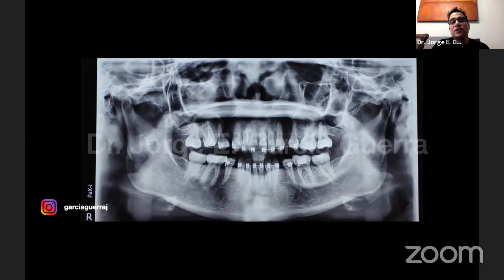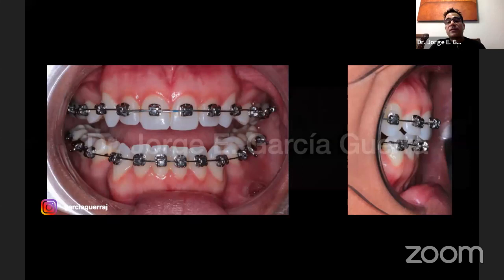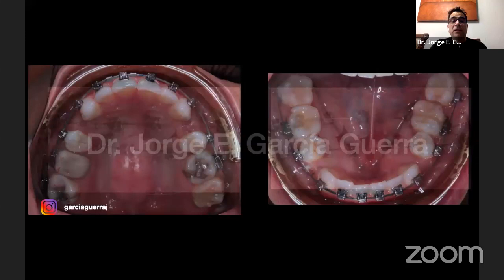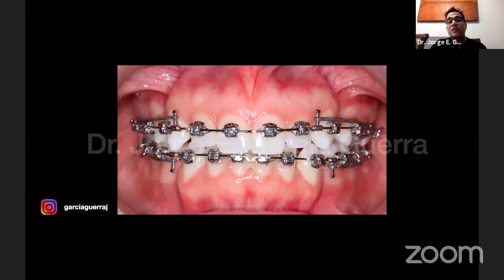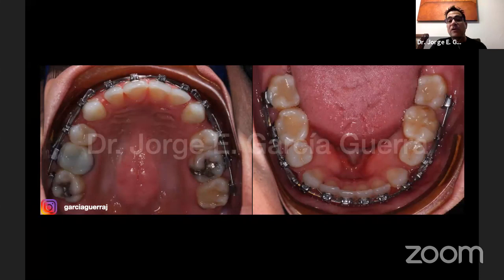Now, in this case, we can see here we have a better alignment. Okay, we start correcting the lateral bite and the arch form. So we start closing the spaces and we also start seeing that she still has an excessive overbite. And she also has a little bit of a gummy smile.